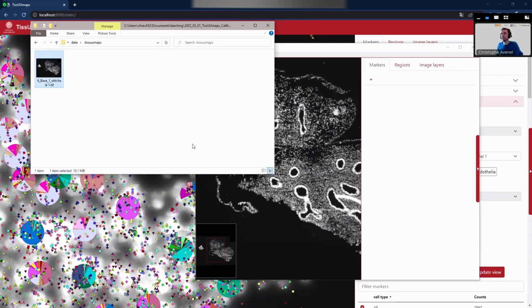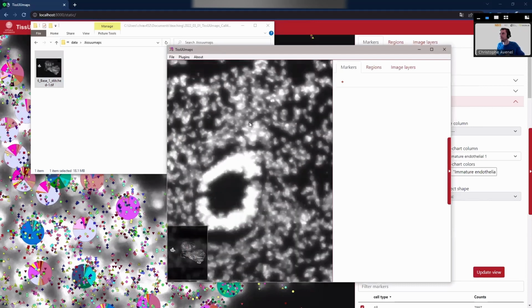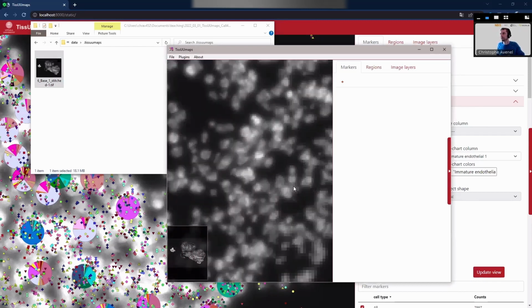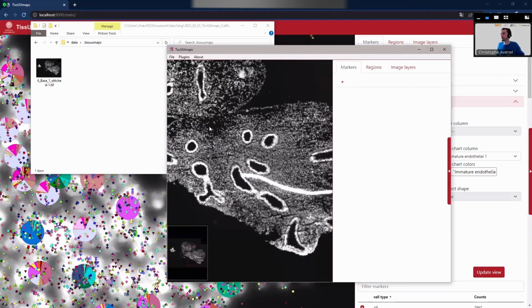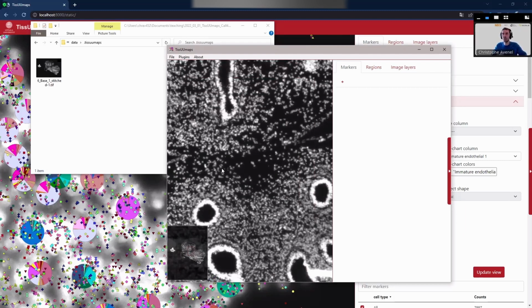from the JPEG one. And depending on the size of your input image, of course, it can take more time to convert it, but this image is now pyramidal, and it doesn't tell you that it converted it, but you can see that it has this .TissUUmaps folder with your high dimension pyramidal image. So in theory, TissUUmaps can open almost any kind of format. It has to be supported by the VIPS library, but it's quite a large range. Unfortunately, there are some new formats every week or month that are not supported.